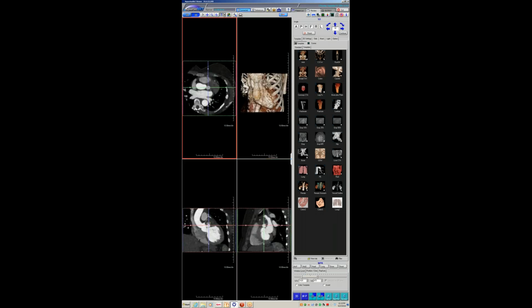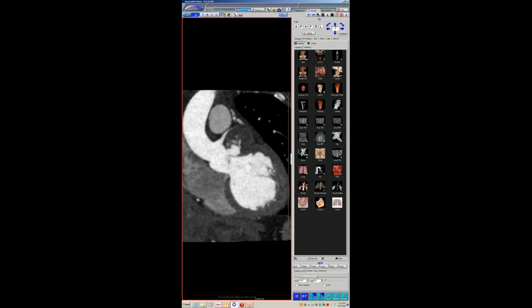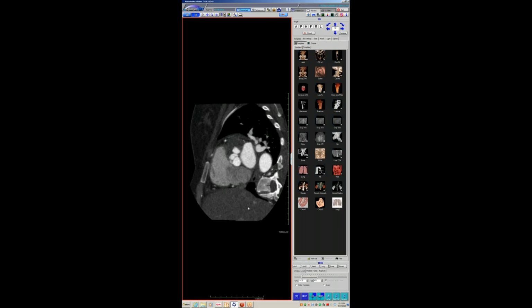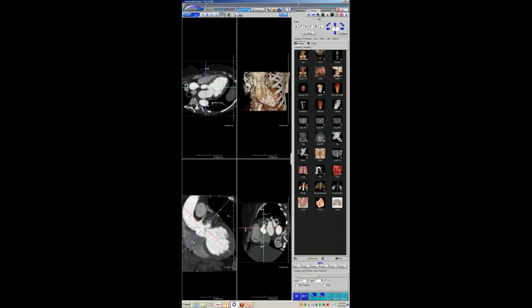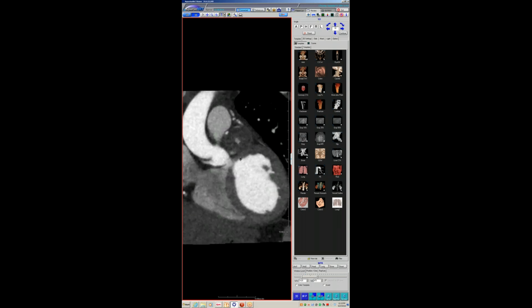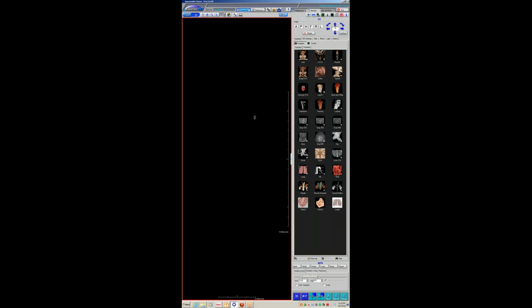So here you can see, in fact, there's this quite large pseudoaneurysm. A lot of these patients have a bicuspid valve. They also have issues with some degree of stenosis. So they must have done, presumably in India, where she had this surgery done, some sort of attempted balloon valvuloplasty, or at least that's what I would assume, that led to a rupture here. And somehow this rupture just walled itself off.